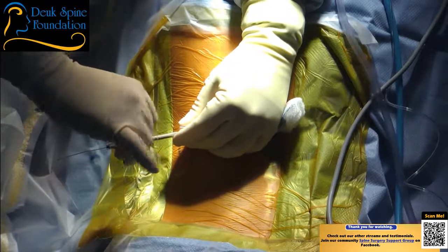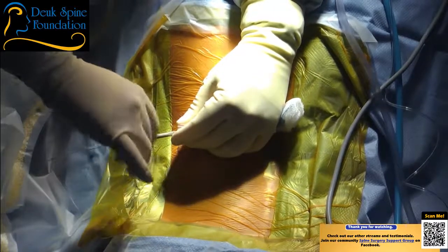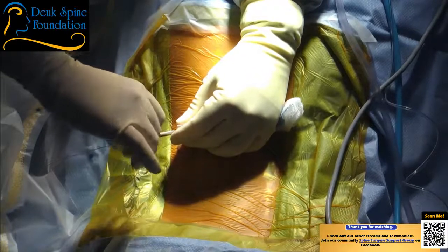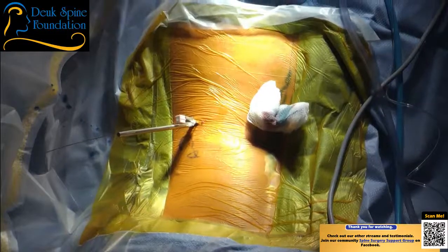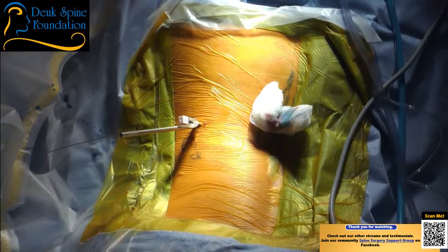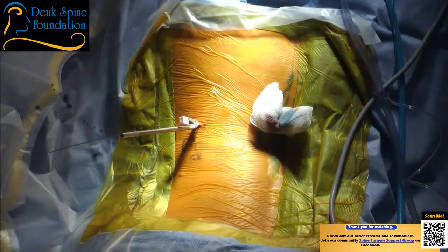You're doing great, Shot. So that's the dorsal fascia right there that I'm hitting. I'm past it. All right, just take it easy. Everything's okay. Any questions from our audience? None so far. The dorsal fascia is the covering over the muscles in the spine, in the back.